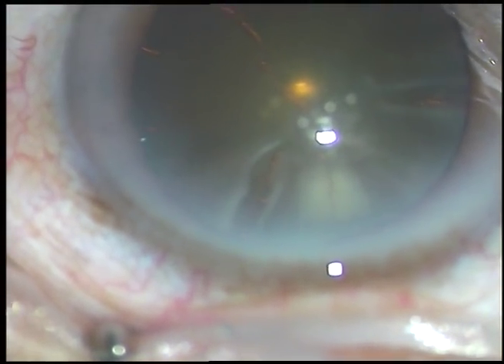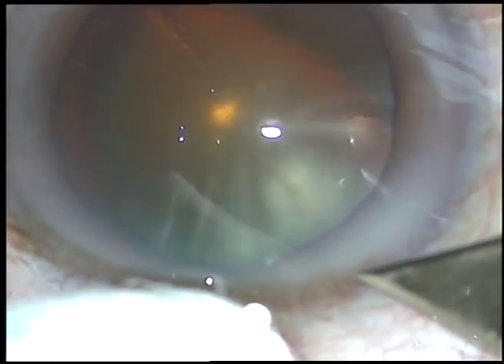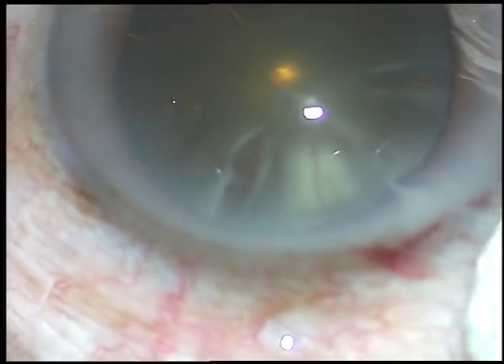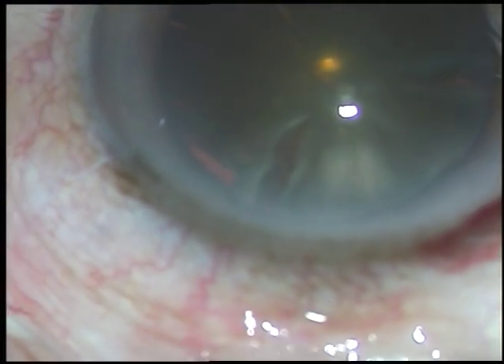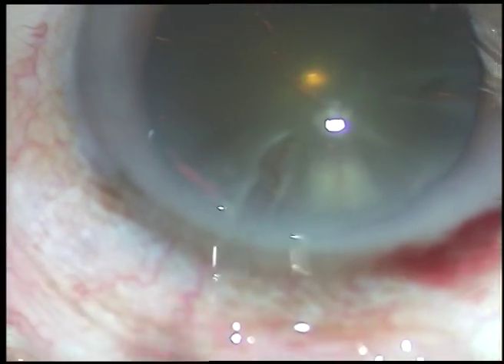And now give the main incision. This is a 2.8 millimeter incision at the posterior aspect of the limbus. You can see some blood oozing out from the lips of the incision. In this case, only one side port has been made on the left side, about two and a half clock hours away from the main incision.